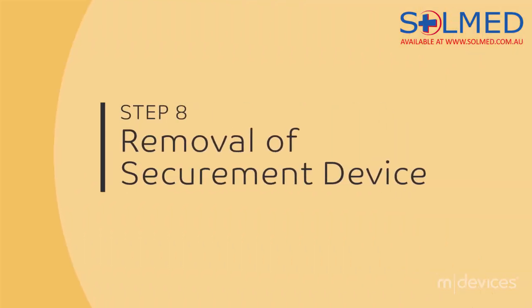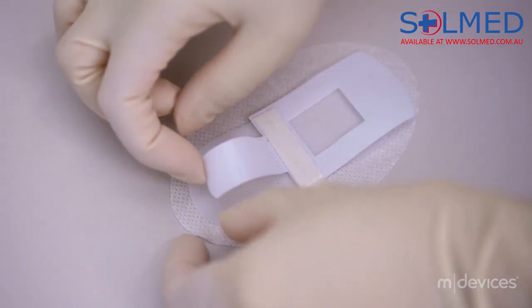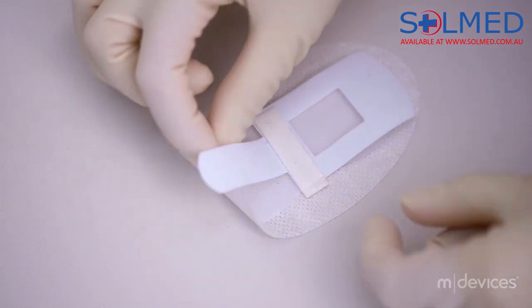Step 8: To remove the universal securement device, gently lift one edge of the dressing and slowly peel away from the skin.